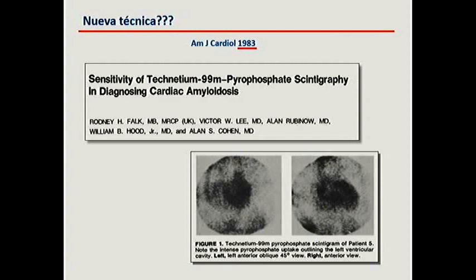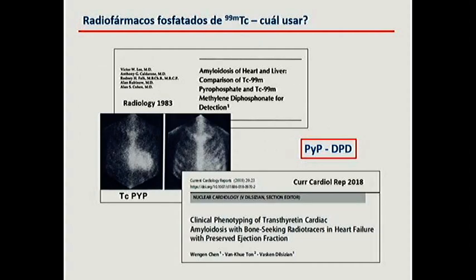But see that there are several works from that time where in the 80s it was quite common to have a scintigraphy, and we would say the patient has amyloidosis, maybe so, maybe not, and that was the end of it, because if the patient was asymptomatic, then there was no other advancement made in the diagnosis. But it was used in acute infarction. And when we had a pattern with acute infarction, we would say it's a massive infarction. And those patients would have amyloids more commonly. But the truth is that this is nothing new.